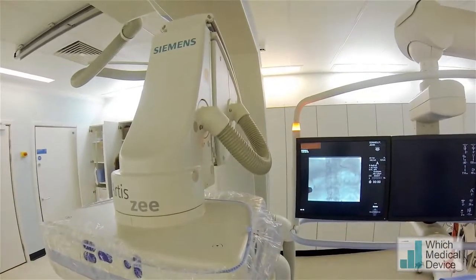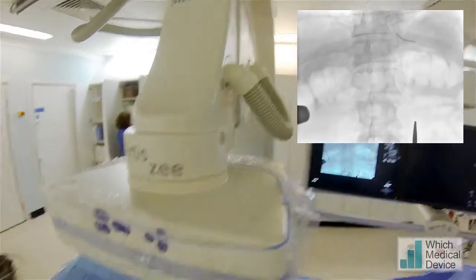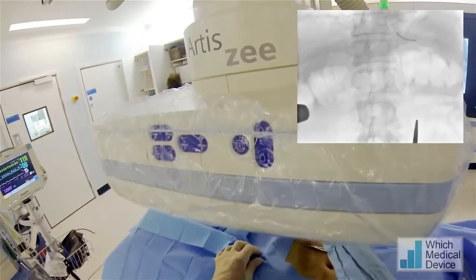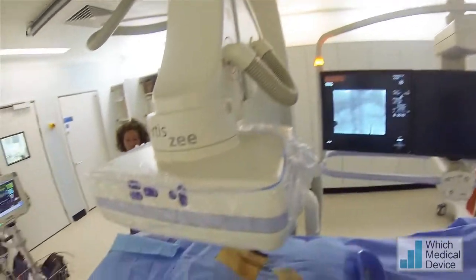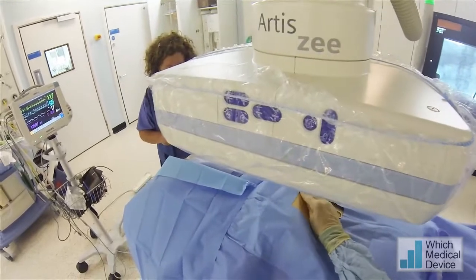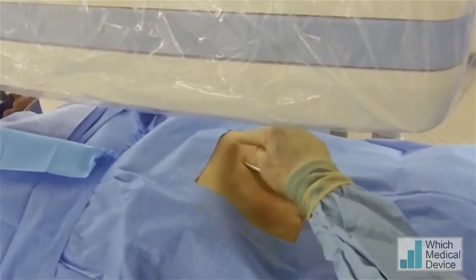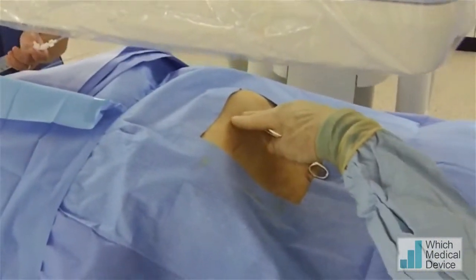We're going to mark the position of the stomach on the image intensifier. You can see the stomach is actually quite high lying, so we'll need to put quite a lot of air into the stomach to bring it down. We really want to bring the stomach down to below the costal margin. The alternative is we'll have a very angled approach up into the stomach.